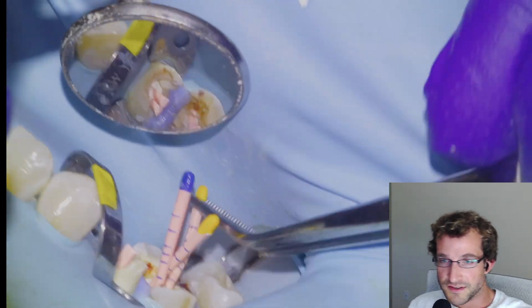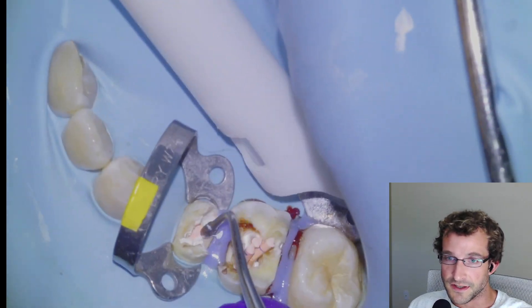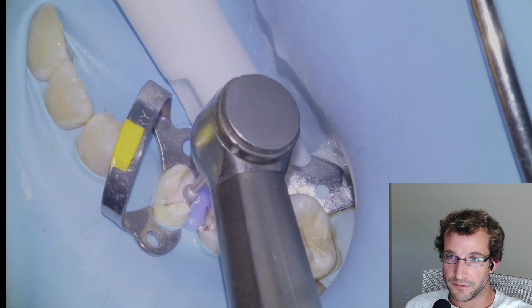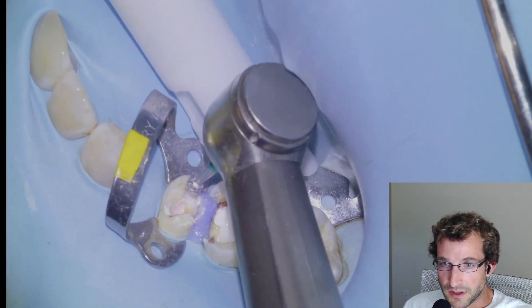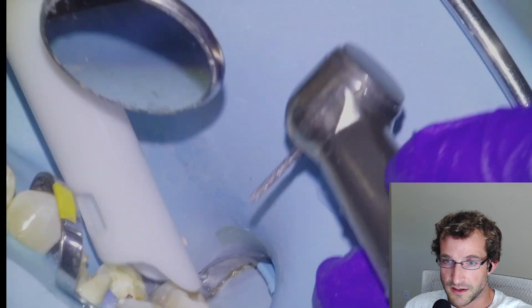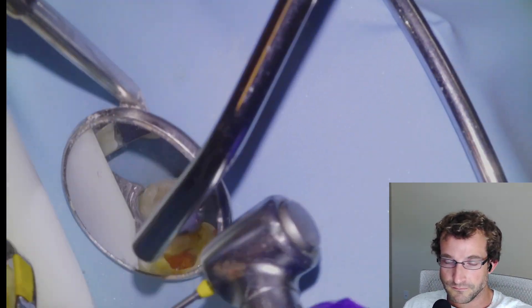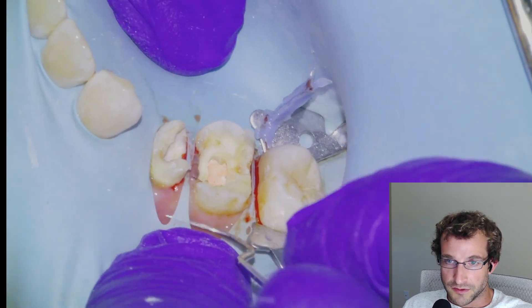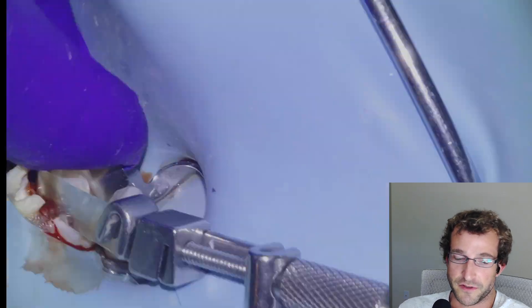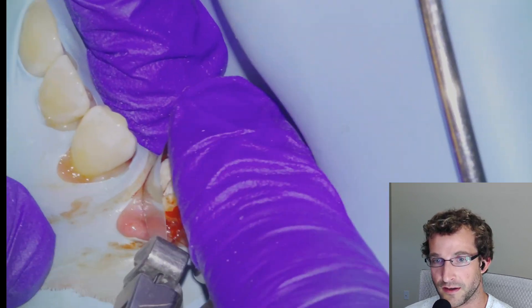Didn't find an MB2 in this case. I recently got a CT and I'd probably take a CT of these teeth before doing endo nowadays — this case was quite a while ago. So we'll sear off the points, finish removing decay, and get our teeth ready for buildup using Equia Forte. Especially in the 5, we'll try to get a little bit of buildup material into the pulp chamber just for retention. We're going to put Toffelmire's around the teeth and then fill them up with Equia Forte buildup material.